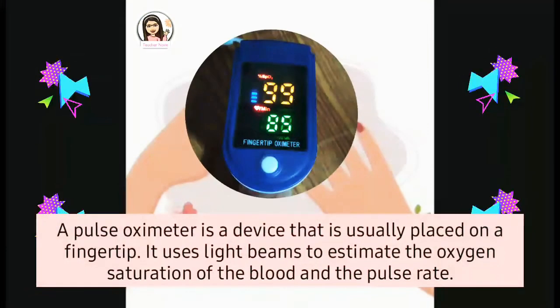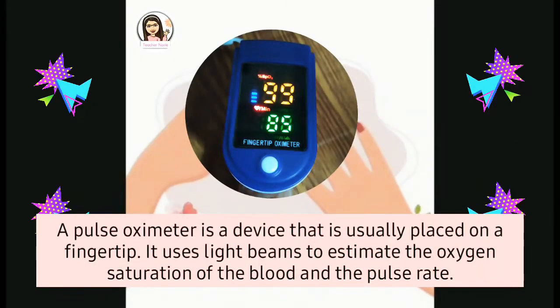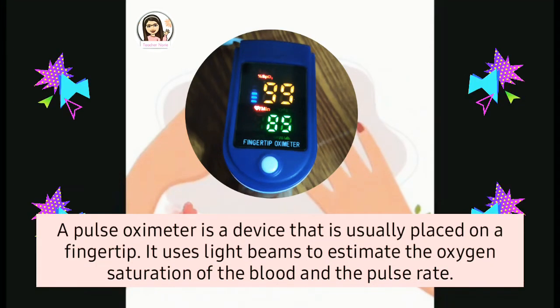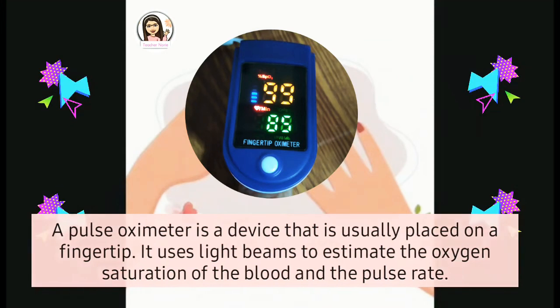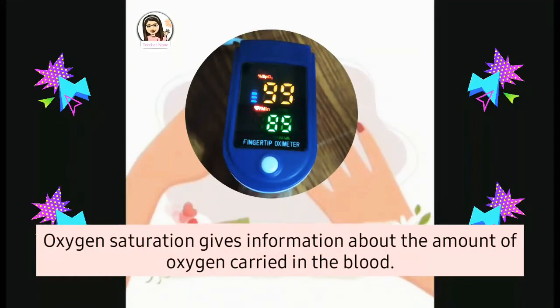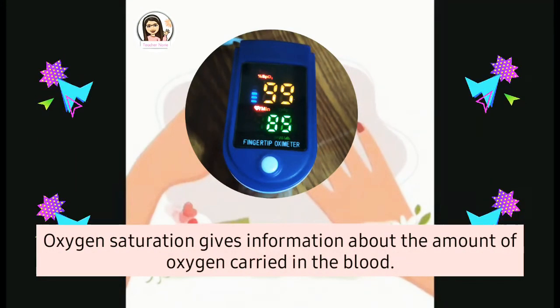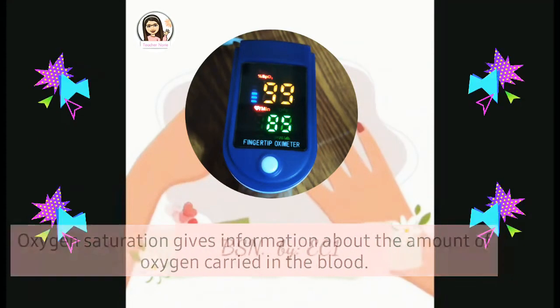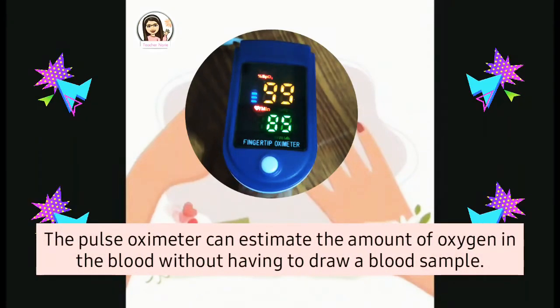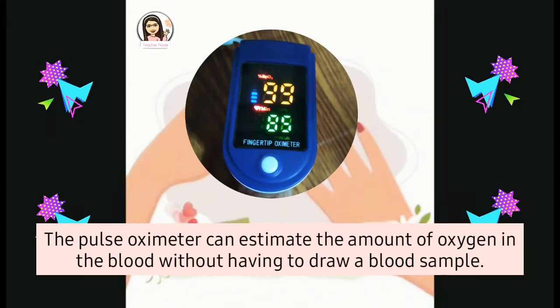This is the pulse oximeter. This is a device that is usually placed on a fingertip that uses light beams to estimate the oxygen saturation of the blood and the pulse rate. Oxygen saturation gives information about the amount of oxygen carried in the blood. The pulse oximeter can estimate the amount of oxygen in the blood without having to draw a blood sample.